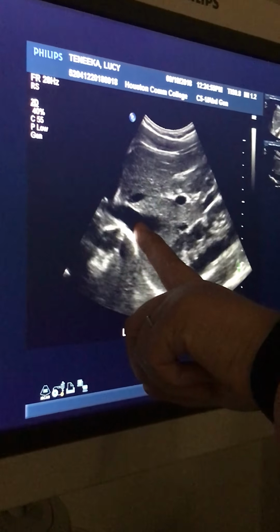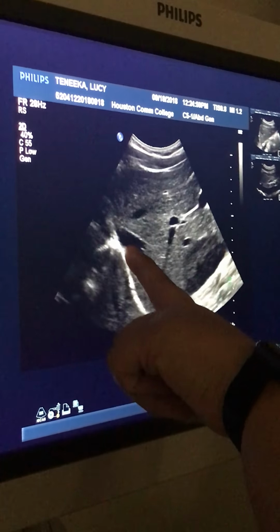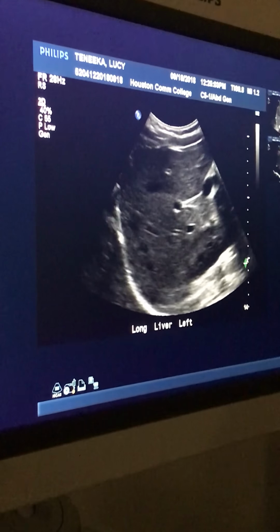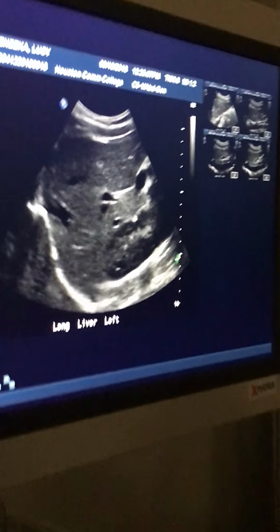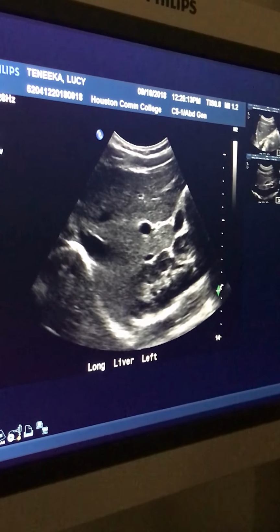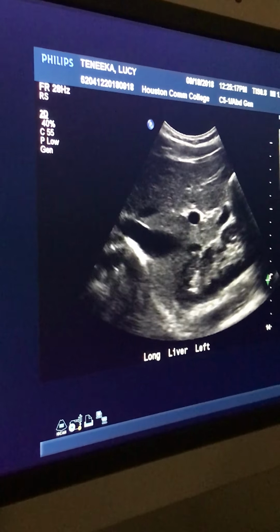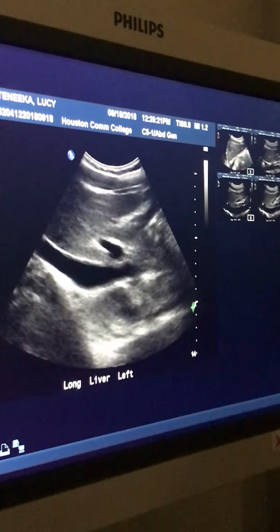Exactly, that was on the quiz today. There's your IVC. If I angle back here, there's hepatics, right? So for this image, you can or cannot give me the gallbladder and kidney. It doesn't matter. I just want the right portal vein. If you do give me the kidney and the gallbladder, it needs to look nice. You're never going to have the IVC coming through. We don't want that.